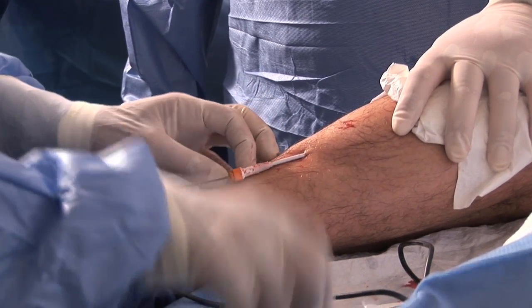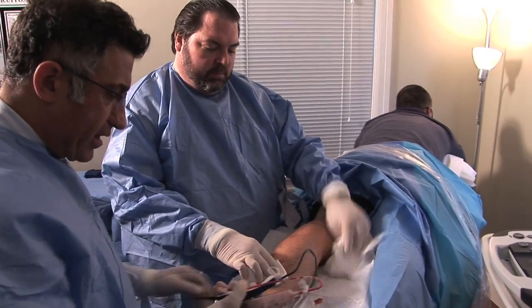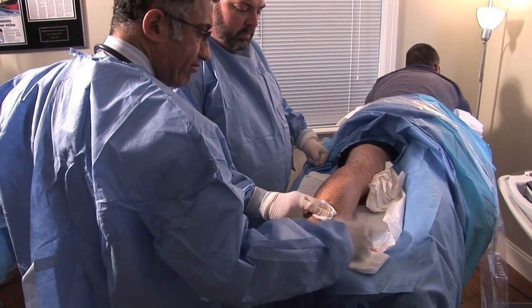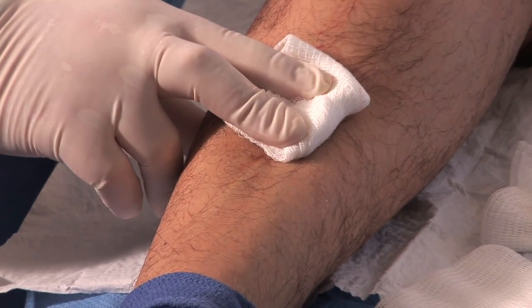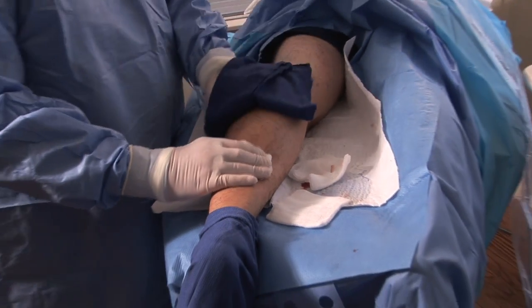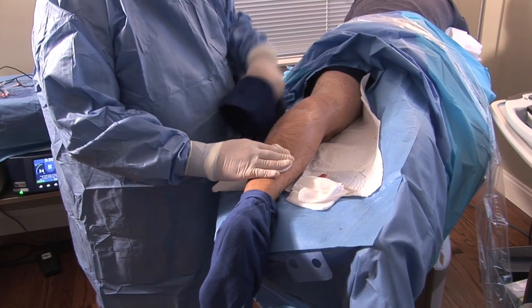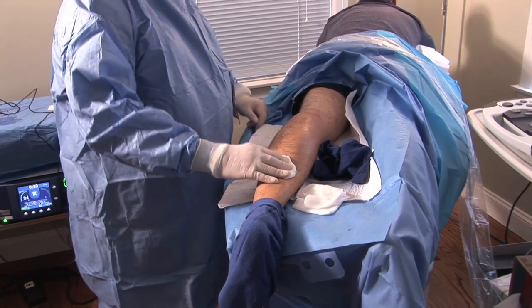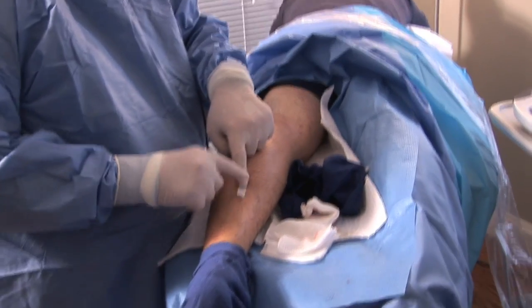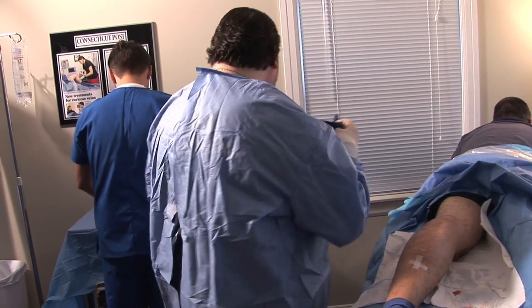Once the whole length is ablated, we remove the catheter. The patient's leg is cleaned. We apply pressure to stop the tiny incision from bleeding. We apply a Steri-Strip — no sutures needed. We put the patient's stocking on; the stocking is supposed to stay on for 48 hours around the clock and one week on in the morning, off at night. That is the vein institute protocol. Different institutions have different protocols, and the patient can go back to normal activity.